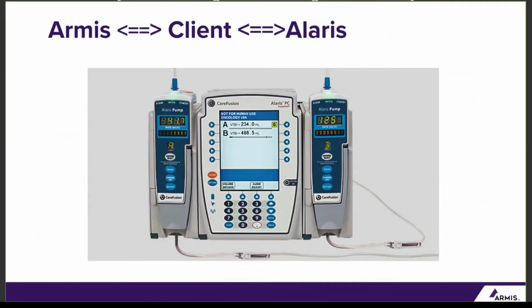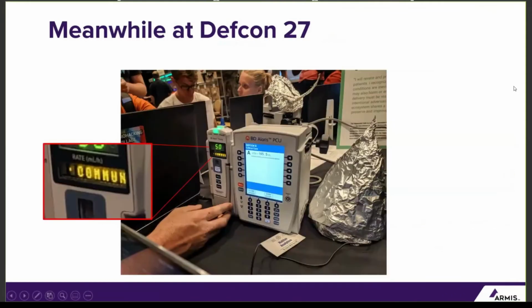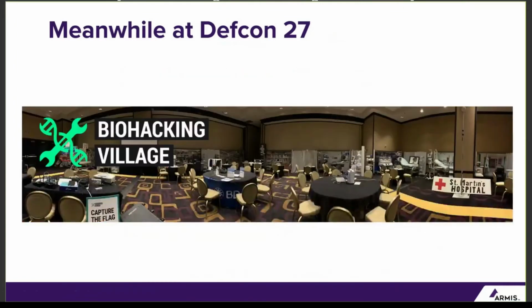Turned out that not only was this specific pump not running VxWorks, it was running IPNet, and it was vulnerable to a subset of the attacks that we had identified in relation to VxWorks. So what this ultimately led to was discovery that this wasn't just impacting VxWorks, but rather was impacting potentially a number of other devices using other operating systems, et cetera, which leads us into a very interesting other dynamic as part of this story.